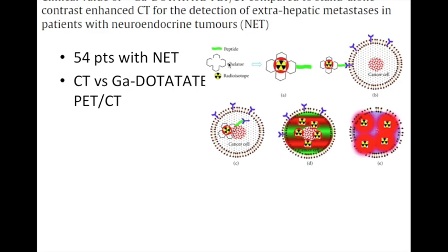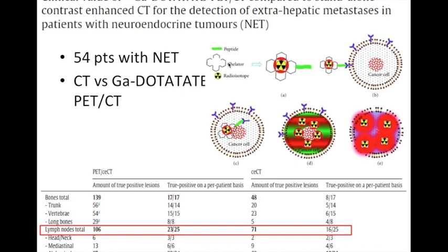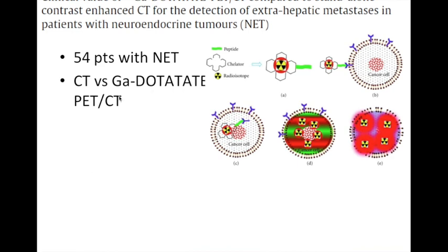So that's one thing that makes it better. And then the other big thing is that it's combined with PET instead of SPECT imaging. So the images are sharper and it's a little easier to demarcate the tumor. So PET imaging is just in general better than SPECT. There's not a ton of great literature, but a couple quick studies on this.